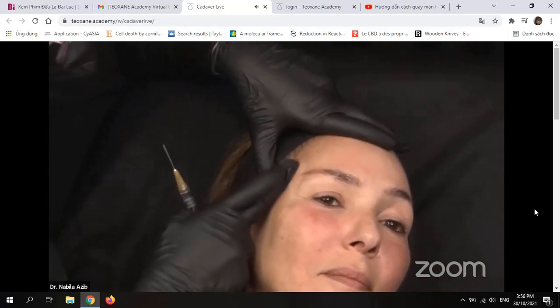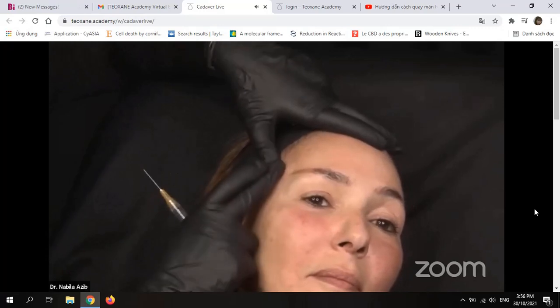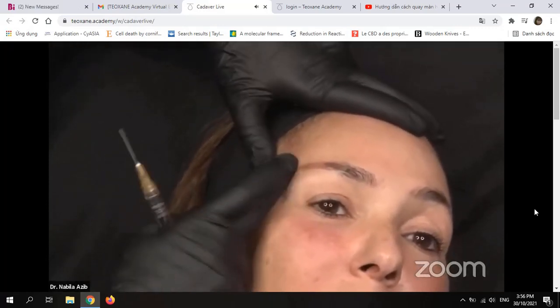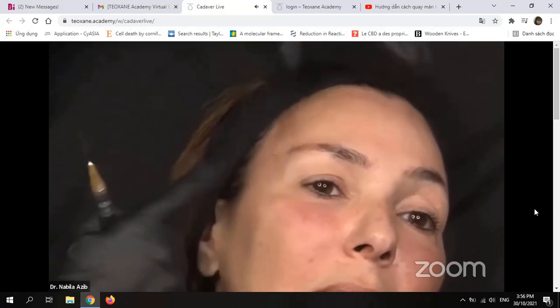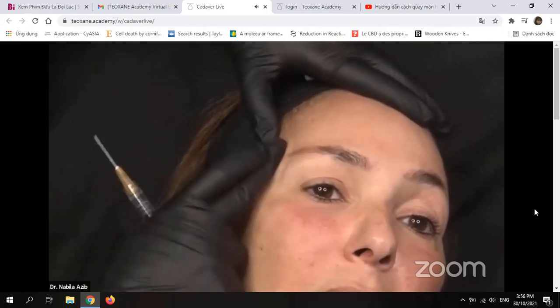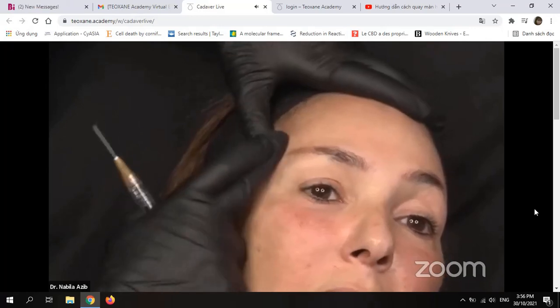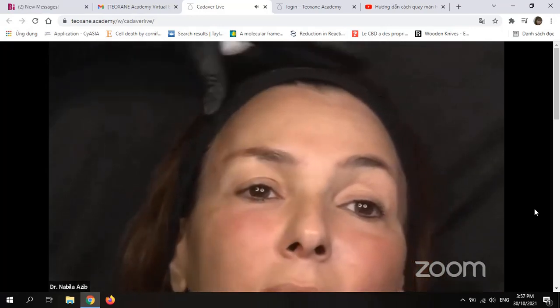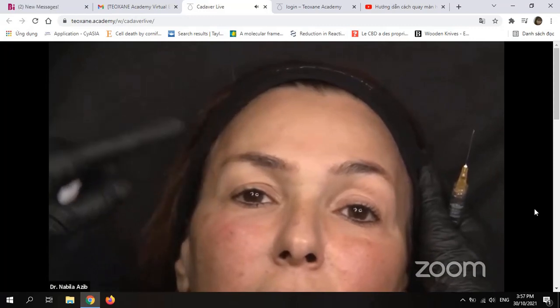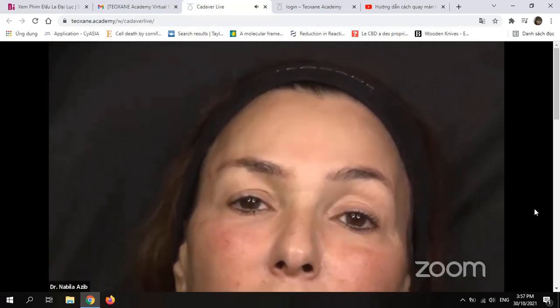So look at this bump. I will just model it, spread it like an implant. It was injected under the temporalis muscle, so you know here, and Patrick will show you that we have no risk of migration when we inject under the temporalis muscle. Very nice. And we can see the lifting of the lateral part of the brow. Exactly. Yes. We may have some swelling, but we can see the result.